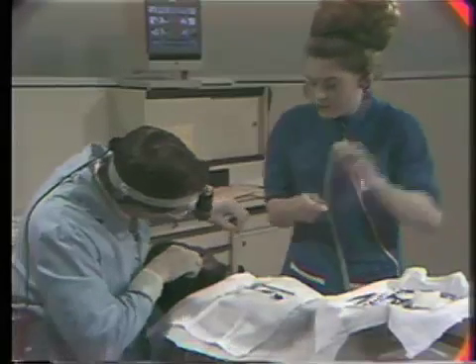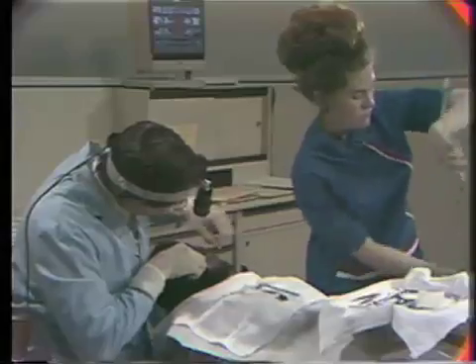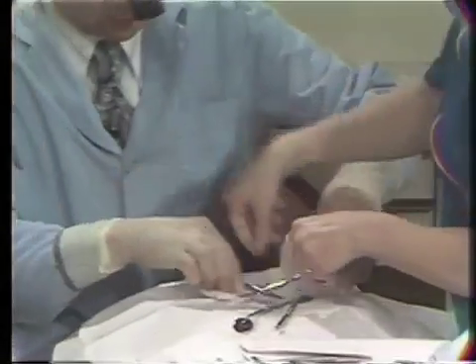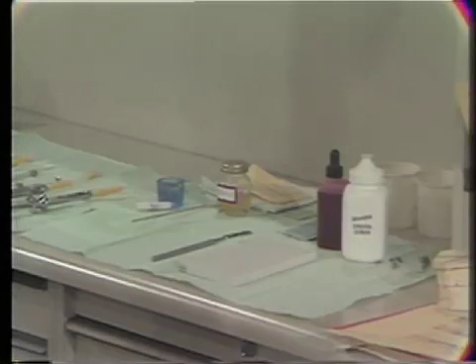After we get this tied, we'll then go to the placement of the dressing material. The sutures are completed. We'll now place the dressing. Mix up 12, Betty.